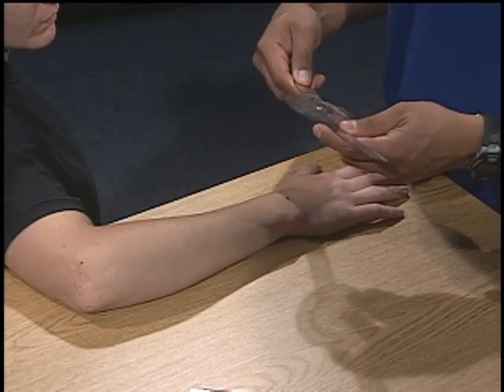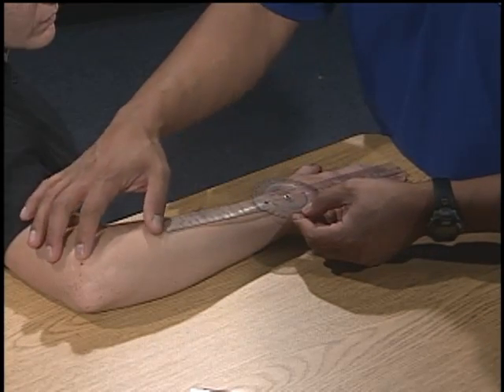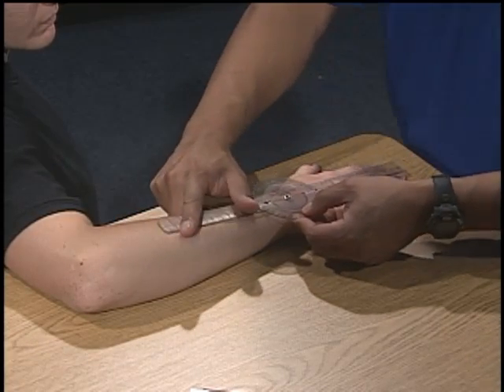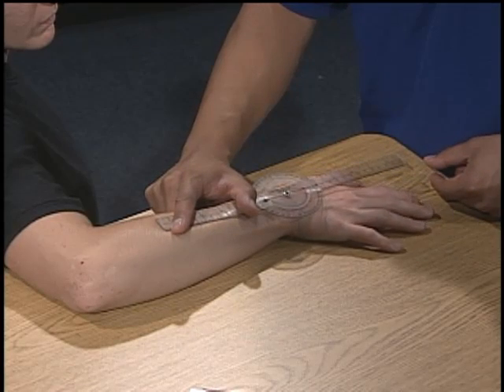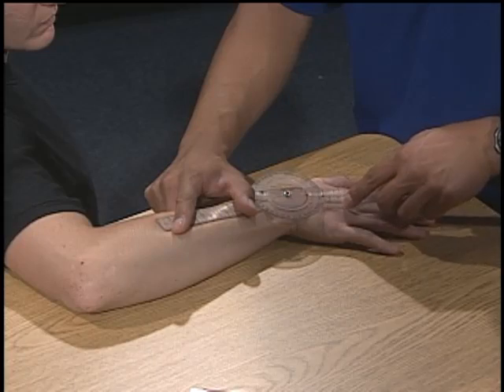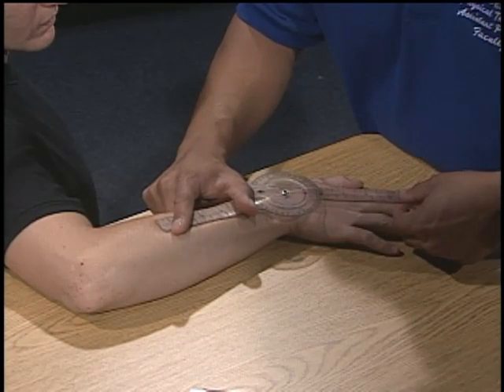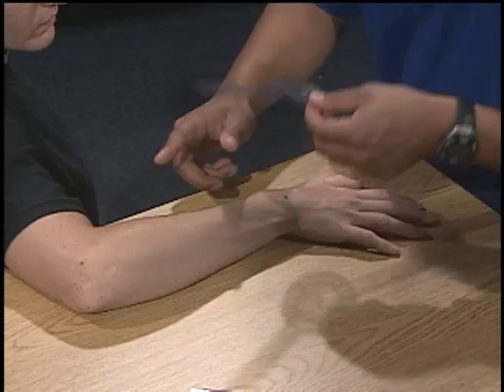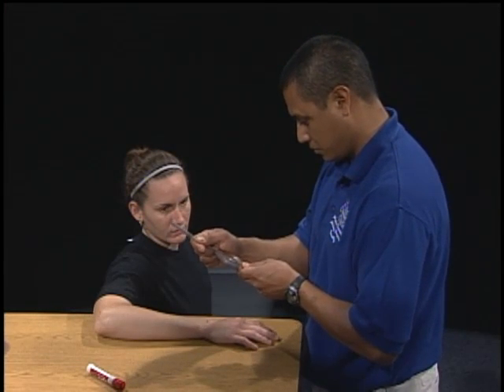Ask the patient to perform ulnar deviation of the wrist as done previously, maintaining the goniometer in alignment through the entire range of motion, and observe for any extraneous movements of the forearm and elbow. Read the degrees of motion on the goniometer and then ask the patient to return the wrist to the starting position. Remain at eye level of the goniometer when reading the measurement. Make a note of the amount of degrees measured.